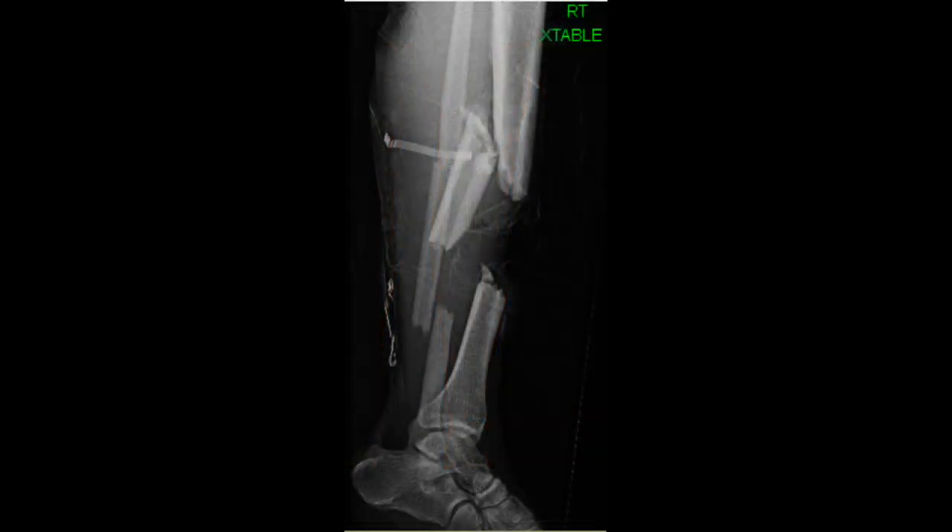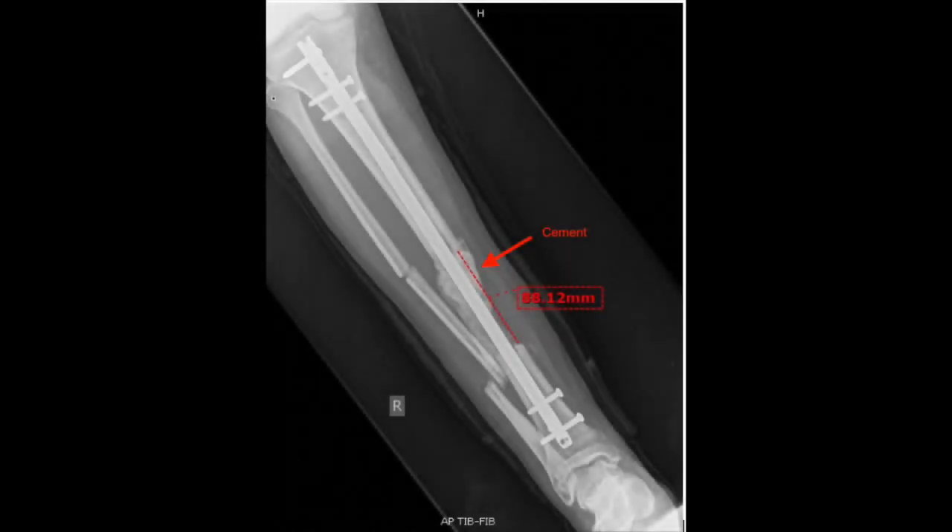In this case, a 35-year-old male presented with traumatic open segmental tibial and fibular fractures and soft tissue compromise of the right lower extremity. The patient was taken to the OR for irrigation and debridement as well as placement of an external fixator. He underwent repeat debridement two days later with removal of 9 centimeters of devitalized bone from the tibia. The external fixation device was removed and an intramedullary nail was inserted, as well as an antibiotic cement spacer across the osseous defect as part of Stage 1 of the induced membrane technique.